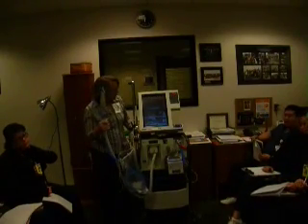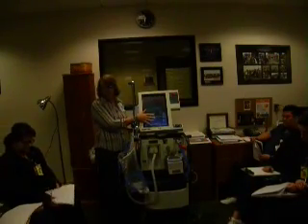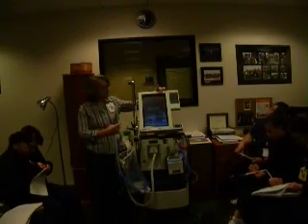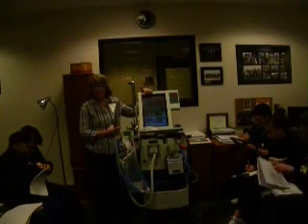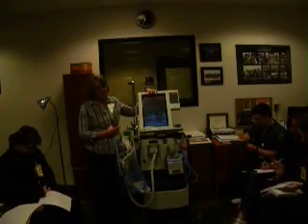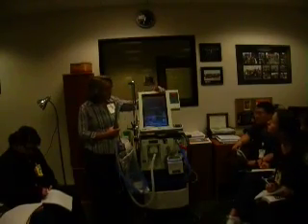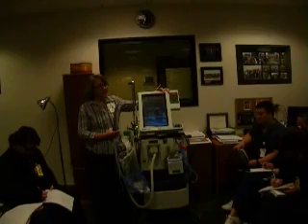Okay. So now once you do that, you're going to get to the other screens that you need that are part of our 4. So this was our set parameters down here at the bottom. Patient parameters is up here at the top. So we've set where we want it to be. Here's the actual readout up here at the top. So you'll see from left to right, you have P peak. That's like your PIP, that's your maximum pressure that's reached with each breath. P mean, mean airway pressure. PEEP, this is your actual PEEP reading. Remember, these are actual numbers. This is what we set. Here's what is actually happening. Your I to E ratio, your rate, your tidal volume, and your minute ventilation.